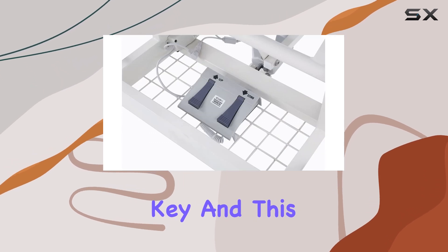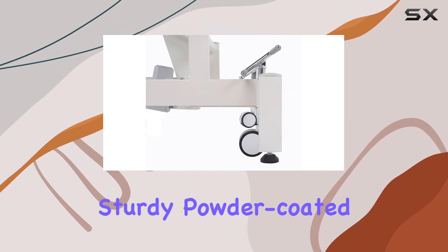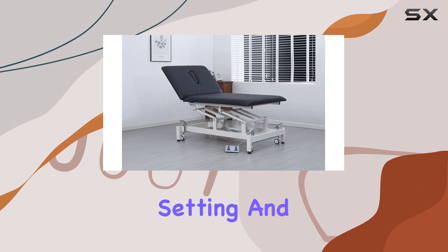Durability is key, and this table doesn't disappoint. With a load weight capacity of 500 pounds and a sturdy powder-coated rust-resistant steel frame, it's built to withstand heavy usage.